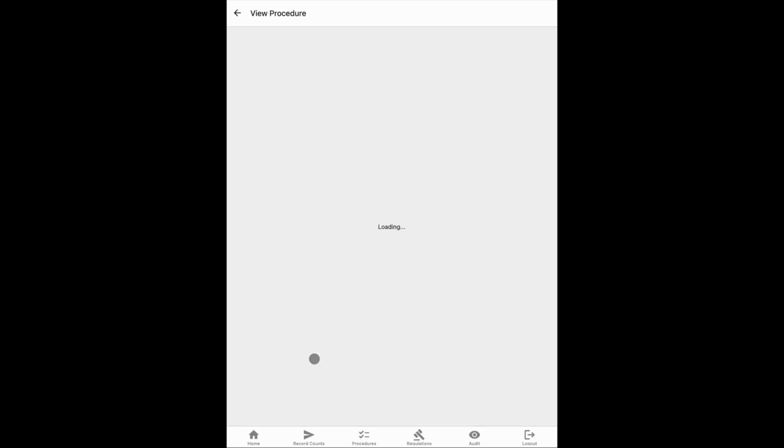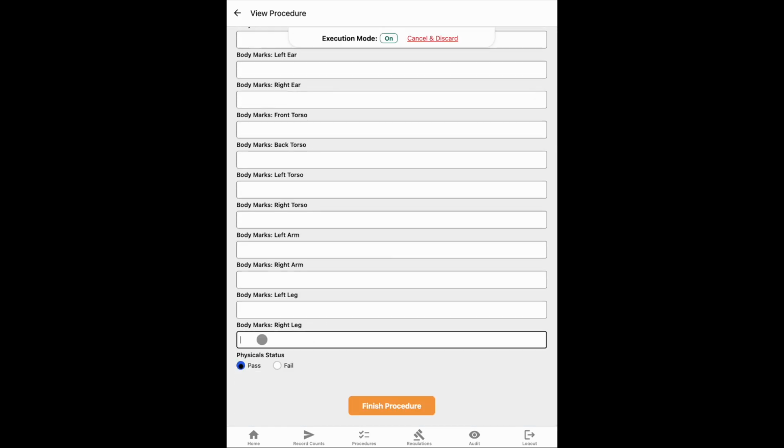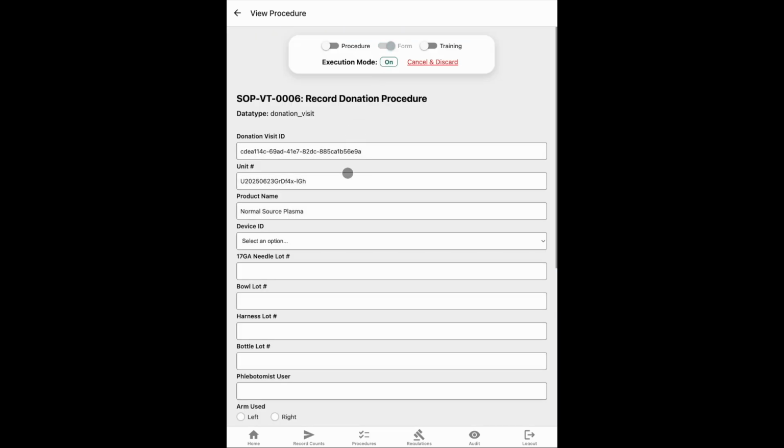Then I'll do the physicals. I'll pass the physicals, and I'll say there's a tattoo on the leg. Record that. Take a look there. There's my physicals. And finally, I'll complete my donation process.